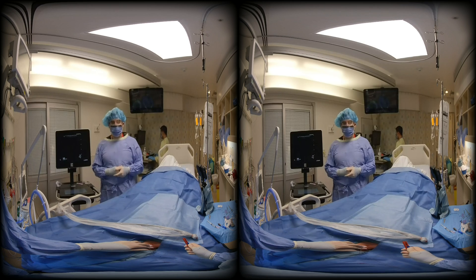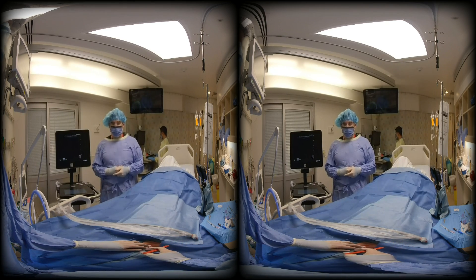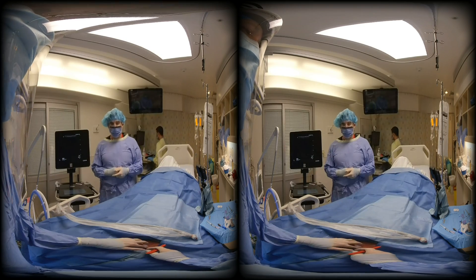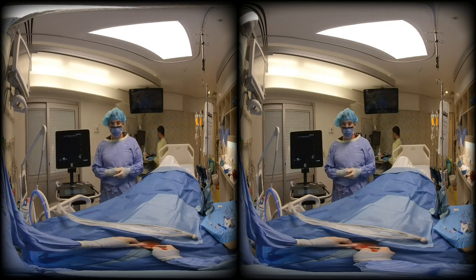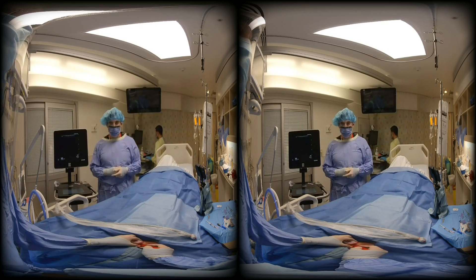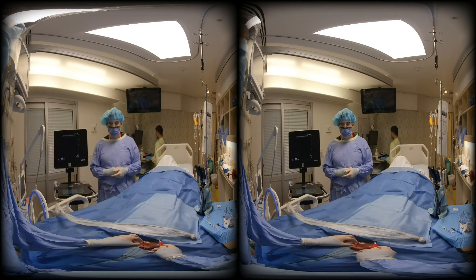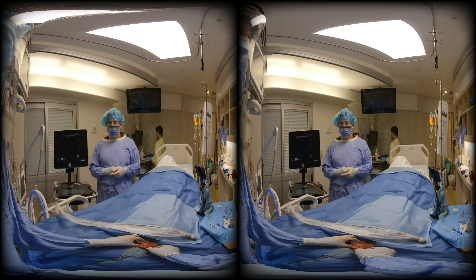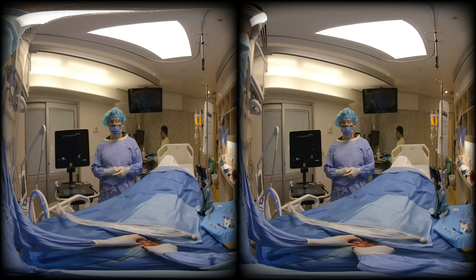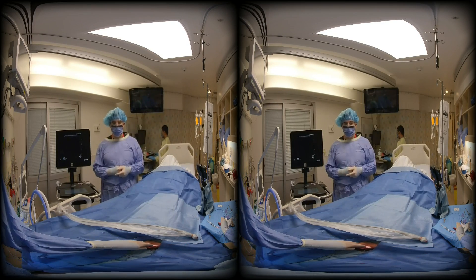Next, here you are making a small incision. Be aware, if your incision is too small you may experience resistance with putting the dilator in. Make sure the blade is facing outwards so as not to nick the wire. That small incision should be about half a centimeter or so, and may need to be extended if you experience resistance with the introducer.